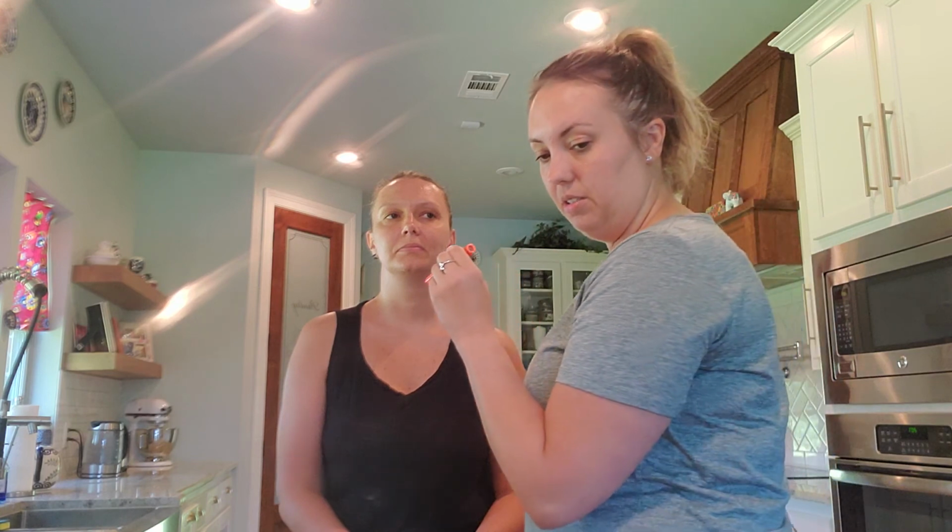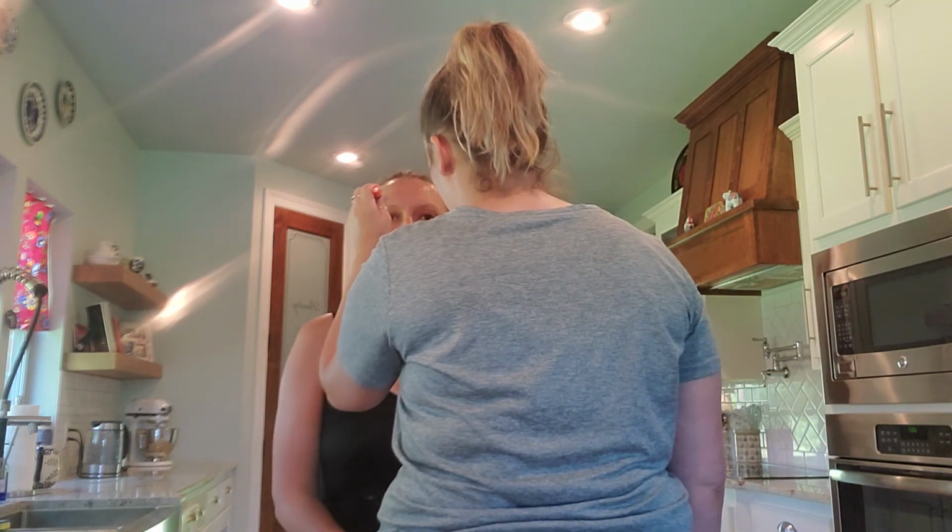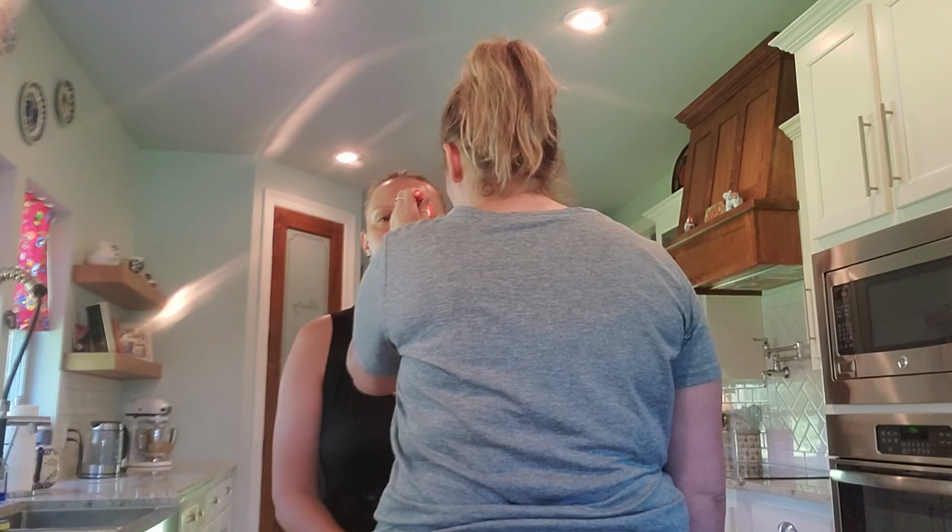Now I'm going to inspect the optic disc. I'm going to stand very close to the patient, keep my light beam focused on the pupils, and move closer to the patient, almost touching the eyelashes. Okay, the optic disc is round with well-defined borders. The disc is creamy pink, approximately 1.5 millimeters wide. The physiological cup is slightly depressed.